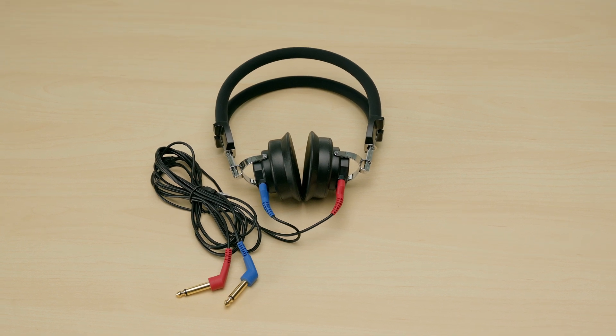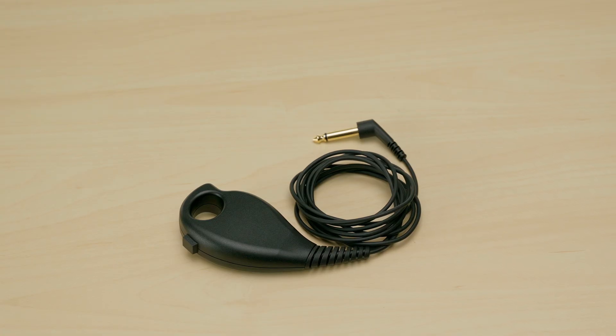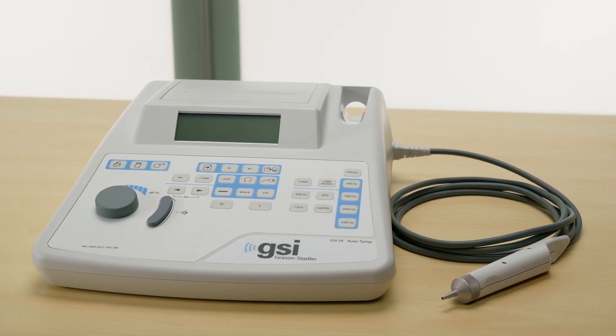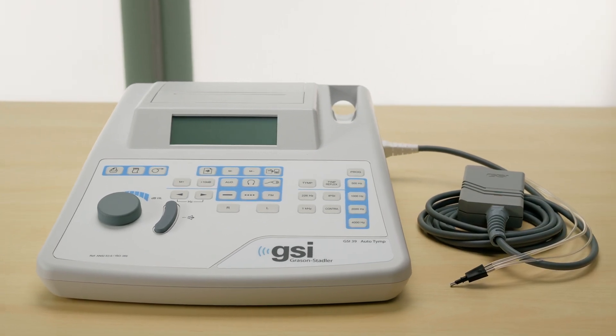If your patient population does not include infants under the age of one year, then the 226 Hertz probe tone will be sufficient. The GSI 39 with audiometry includes over-the-ear headphones. Optional accessories include insert earphones and a patient response button. Additionally, the GSI 39 has an onboard printer and is compatible with GSI Suite for electronic management of screening data. This lightweight desktop instrument can easily be moved from facility to facility using the optional carrying case.